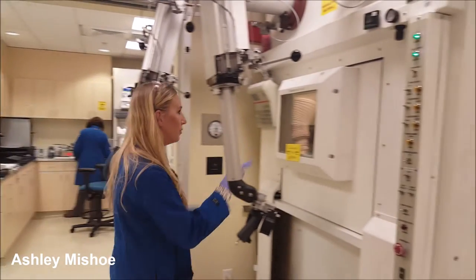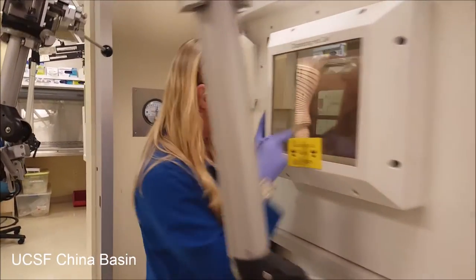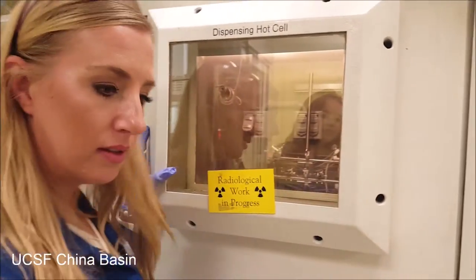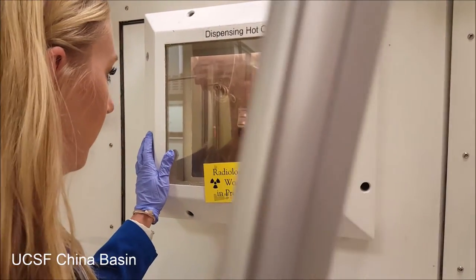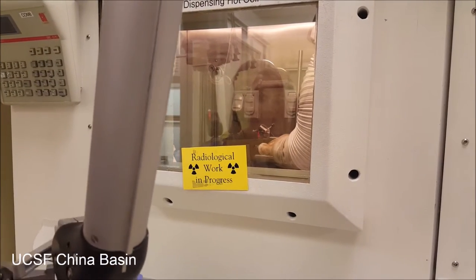It gets delivered through these lines — if you want to step up and take a look in here. It gets delivered through the lines, like this one, and we would have a final product vial sitting on the end of this.